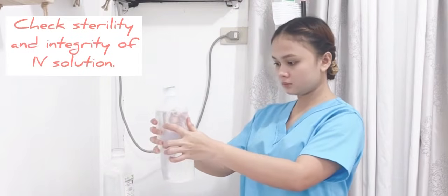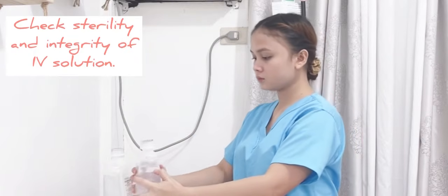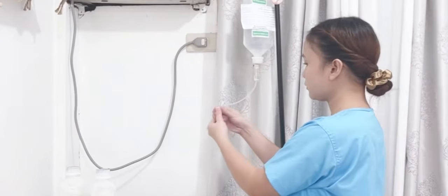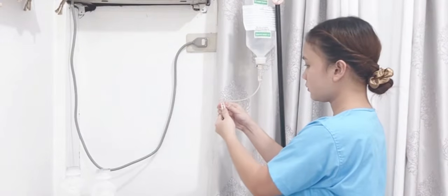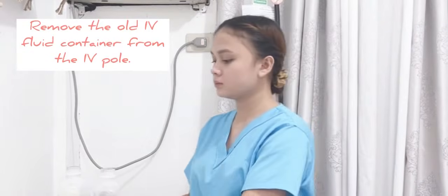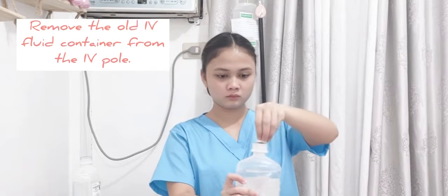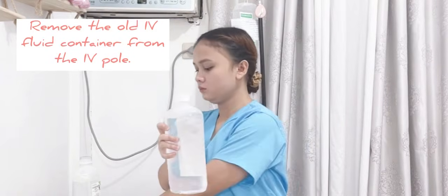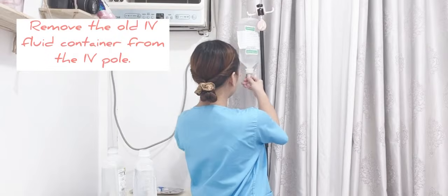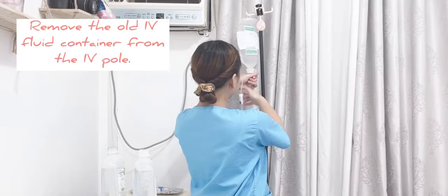Then check the sterility and integrity of IV solution as it maintains sterility of IV fluid. Then after that is to close the roller clamp. Then remove the cover seal of the IV fluid. Then open and disinfect the rubber port of the IV solution as it permits quick, smooth, and organized change from old to new solution. Then remove the old IV container from the IV pole.